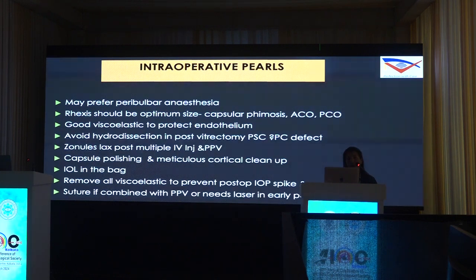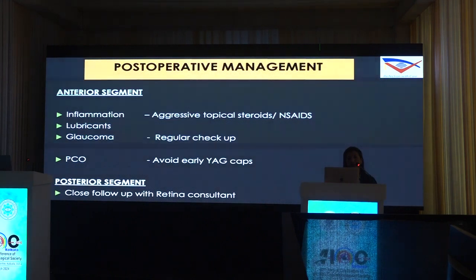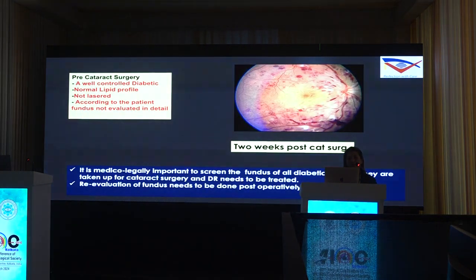And in case you plan to do a combined surgery, or if the patient needs a laser in the early post-op period, do suture your patients. So giving aggressive anti-inflammatory, a good amount of lubricants, and a close follow-up with your retina consultant in the post-op period is important.